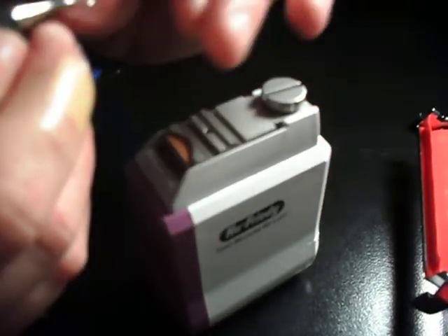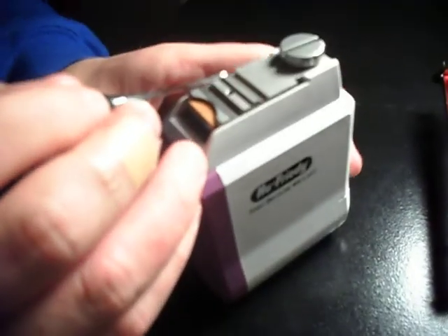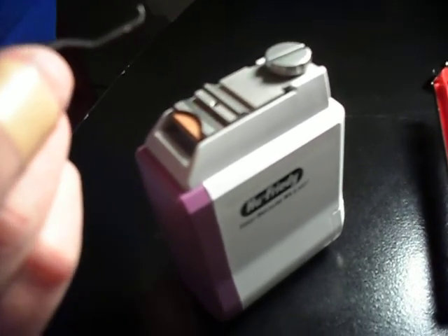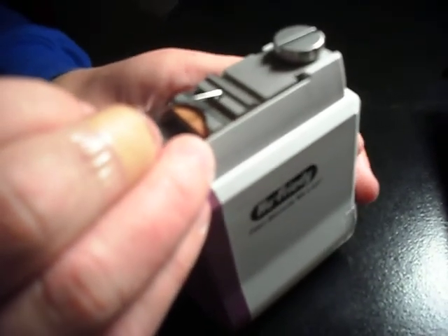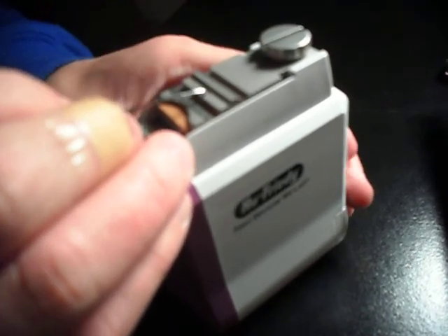Okay. Now, there's one thing you do with a curette that you don't do with a scaler. You have to round off the toe of the instrument because when you put it below the gum line, you don't want it to stab the person. So that's the difference between a curette and a scaler, is it can go below the gum line. So what you want to do is turn it on and put it through this little hole right here.